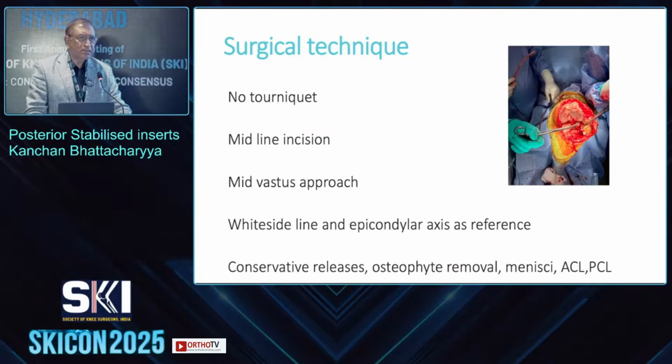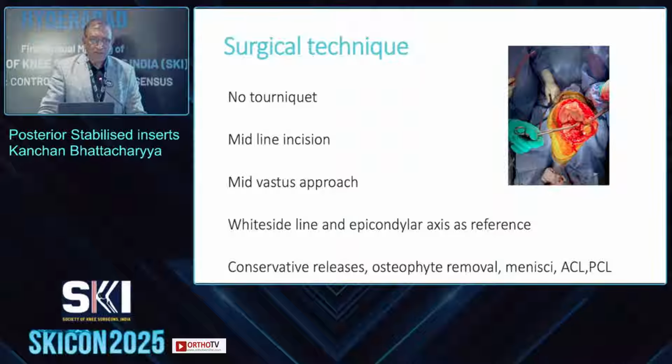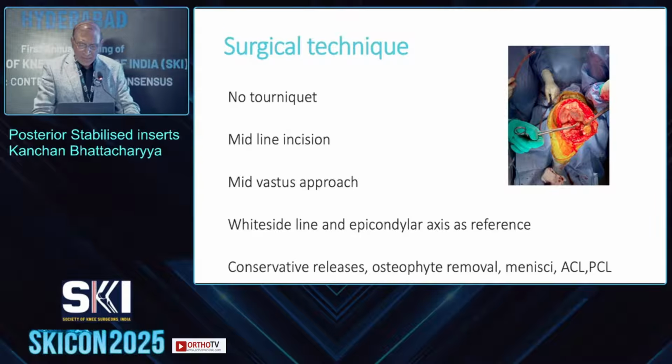Surgical technique, my surgical technique is not much different from any others, except I don't use a tourniquet. Midline incision, a mid-vastus approach, still use the Whiteside line and epicondylar axis reference, regardless of whether they use technology or not. Conservative release, and we've all realized that over the years we seem to have released a lot less. We don't know why. Probably we've learned a little bit more, or we have learned that the osteophytes need to be removed more, and that has made it easier for us.